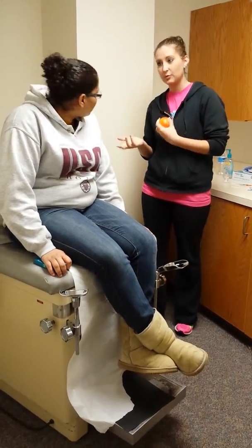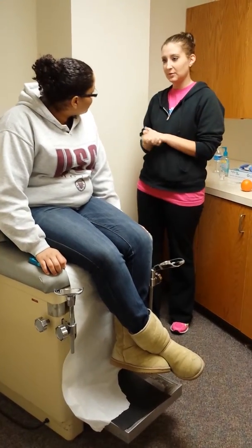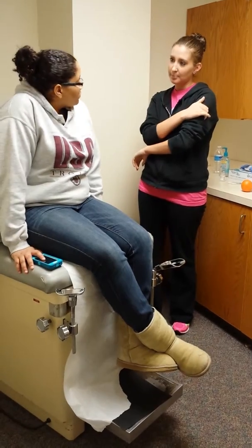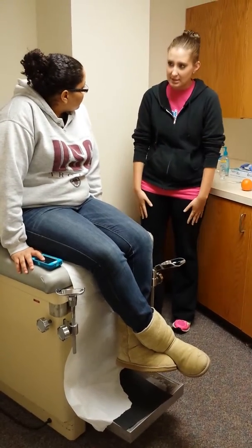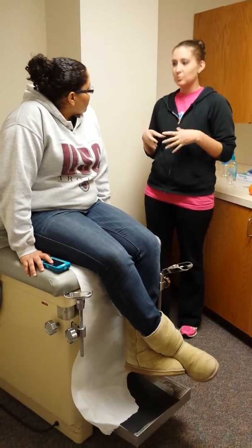Normally, you'll do it on yourself — this is just for today. There are three spots you can give yourself insulin: you can do it in the back of your arm, your stomach, or your thighs. And you want to put it in the subcutaneous tissue, which is more of the fatty part.